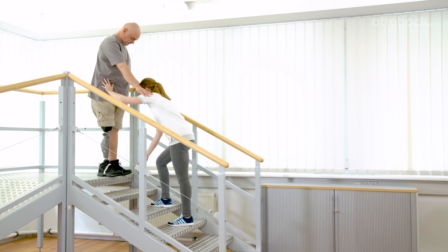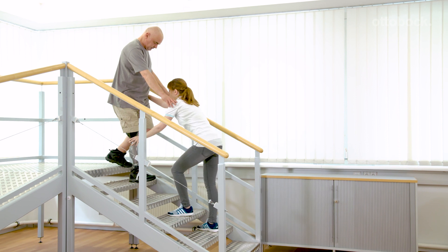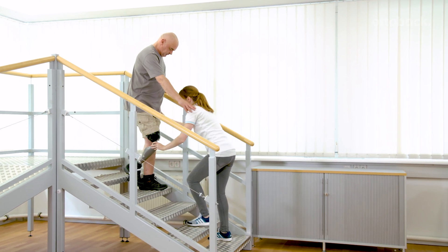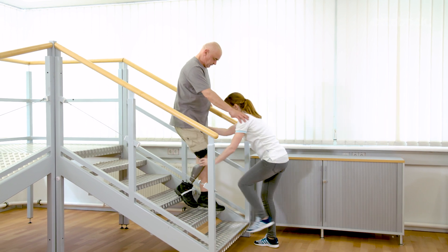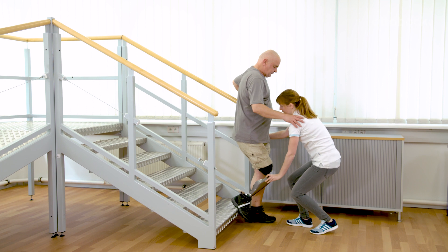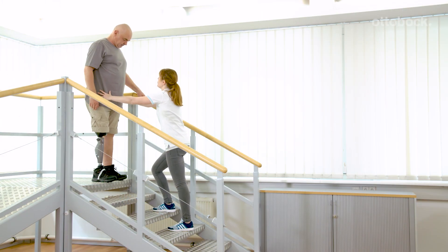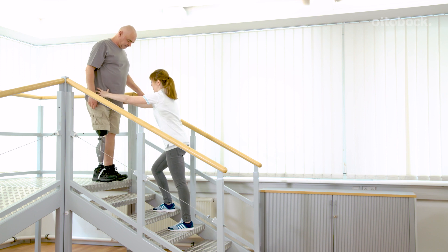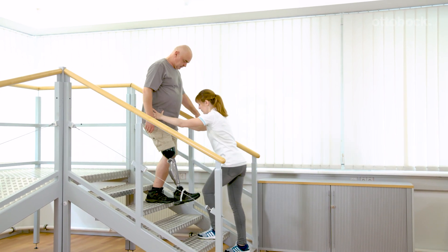The movement pattern will be repeated with a larger number of steps. Gerhard and Franziska show the movement at a very slow pace to better illustrate the foot placement and the support of the therapist. An even gait rhythm facilitates walking downstairs and is verbally supported by the therapist.